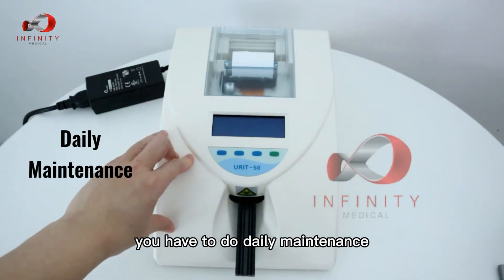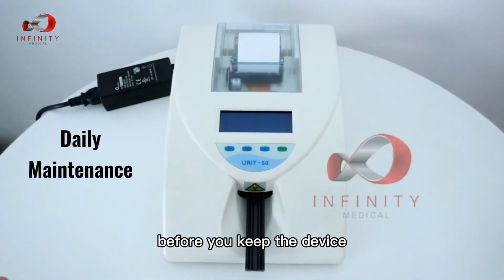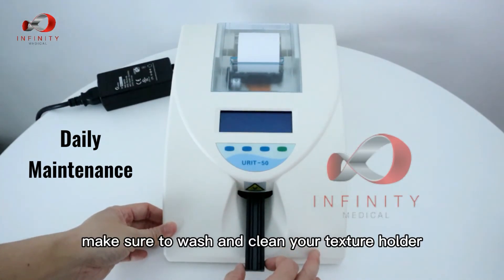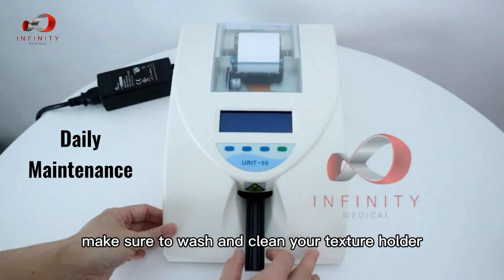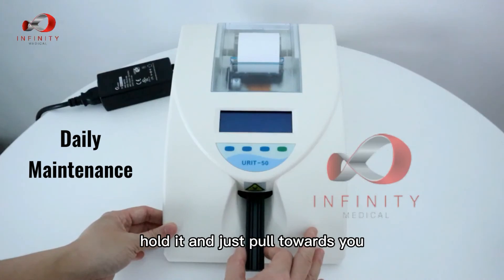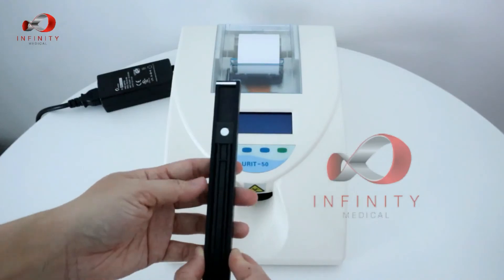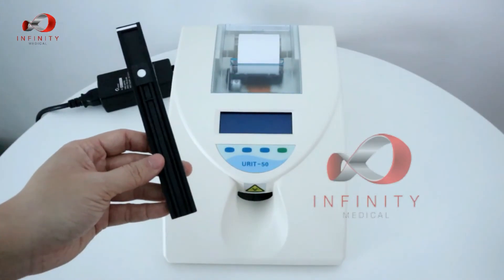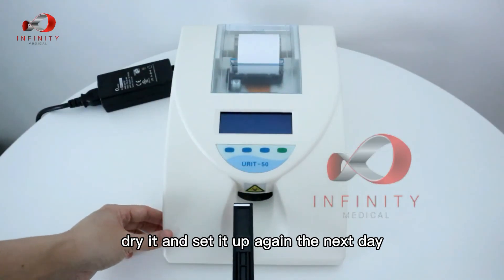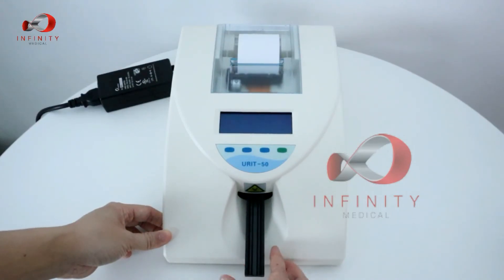At the end of the day, you must perform daily maintenance by removing and cleaning the test strip holder. Use two fingers to hold it and pull it towards you — it will come out easily. Wash it, clean it, and dry it. To reinstall, place it in parallel alignment and push it back in.